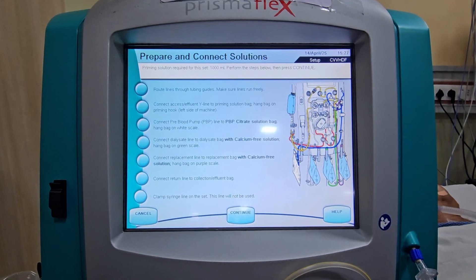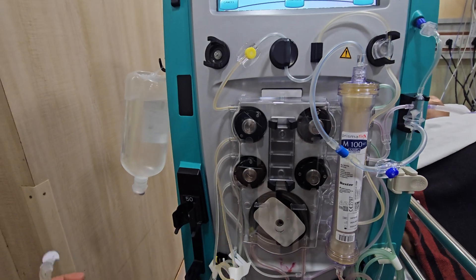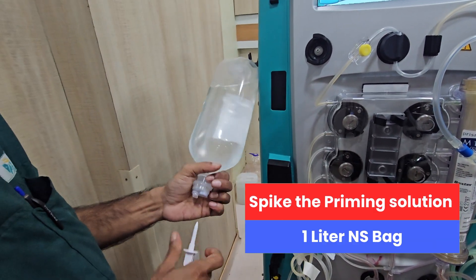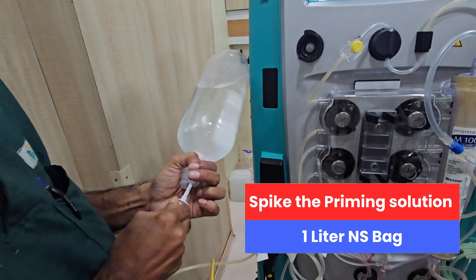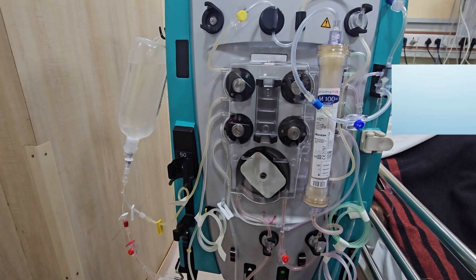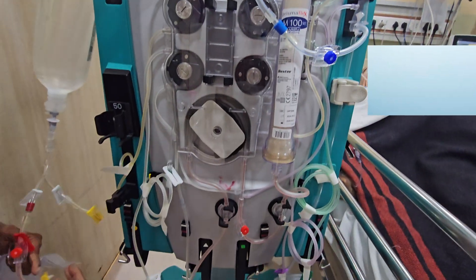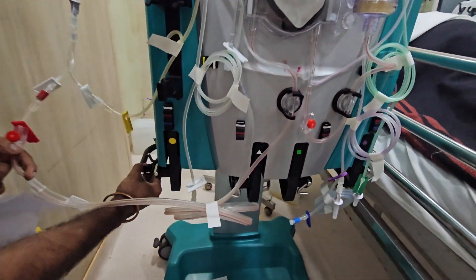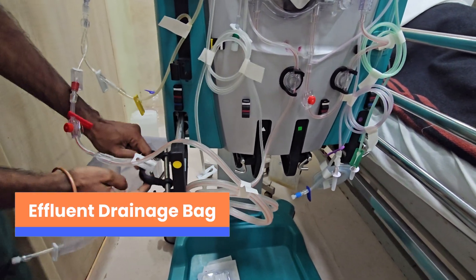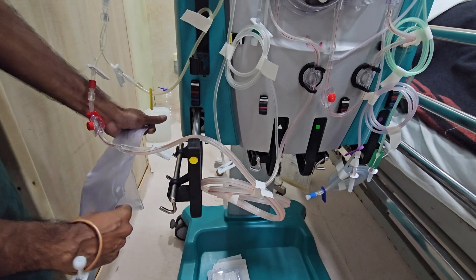Time to load and connect fluid bags. Priming solution is spiked with the red cannula. Pull the yellow scale. Effluent drain bag loaded.